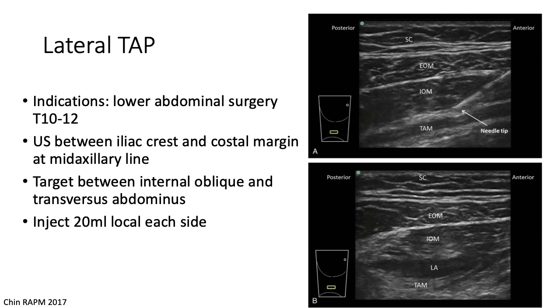The injection of local anesthetic should depress the transversus abdominis muscle. As shown in the lower ultrasound image, after injecting, the local anesthetic forms a dark area between the internal oblique and transversus abdominis, and you can also see the transversus abdominis has been pushed down by the local anesthetic.